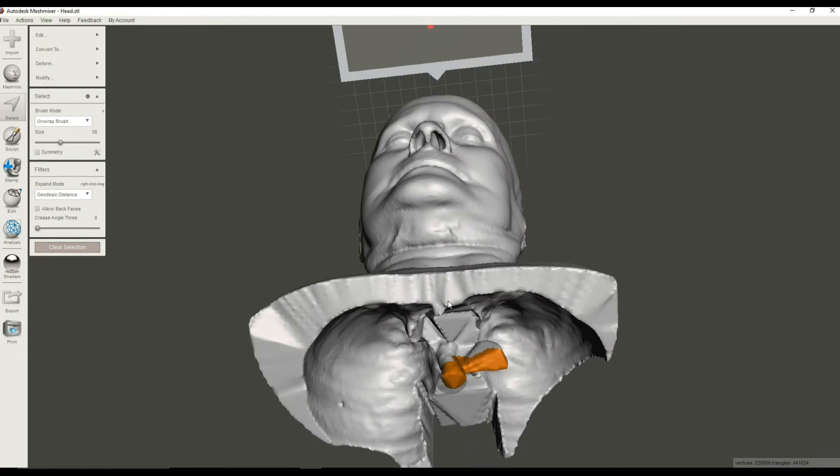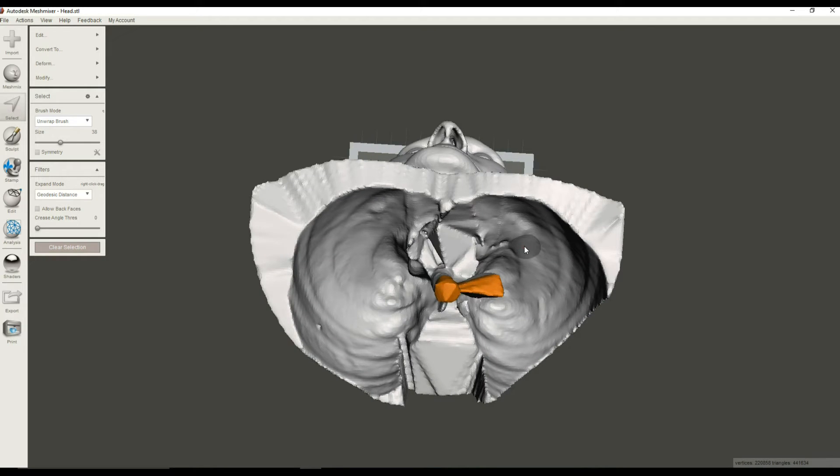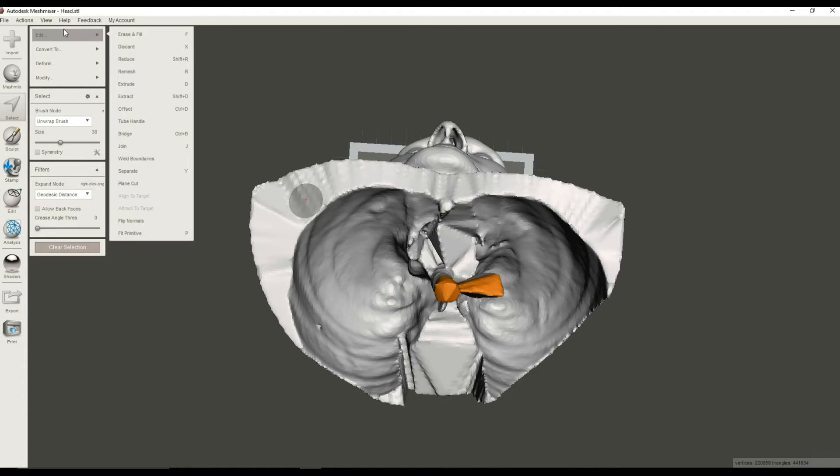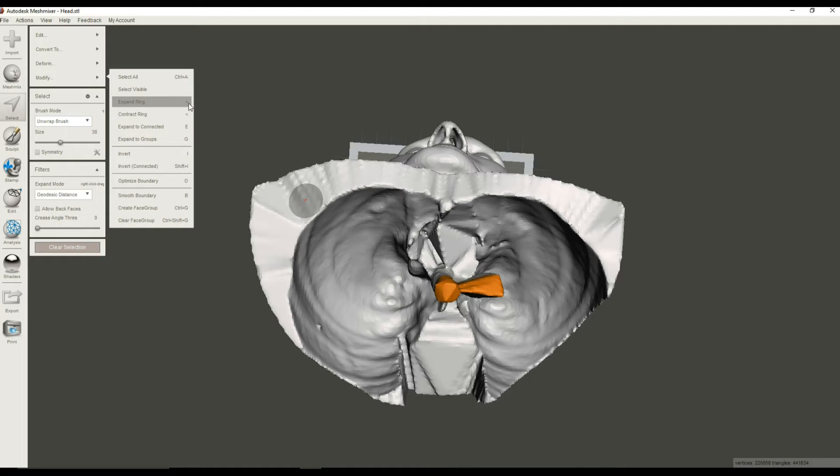Now one of the things that you can do in Mesh Mixer is you can expand your selection so that whatever you have selected, you can kind of grow it out by one layer. And to do that, you go to Modify, Expand Ring. And you can see that you can also use the, kind of like the greater-than symbol.